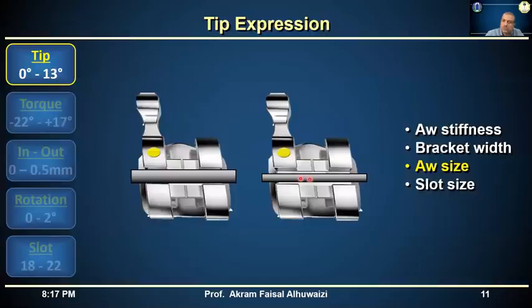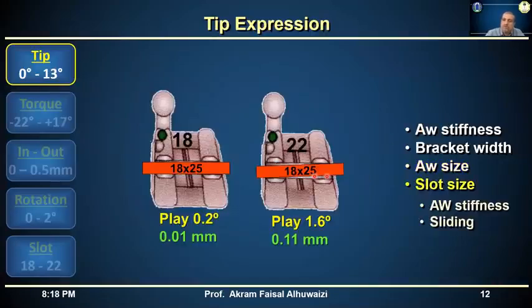What's more important is the stiffness and not the size. Same thing goes for the slot. Should we use an 18 slot? Should we use a 22 slot? Doesn't make that much difference.